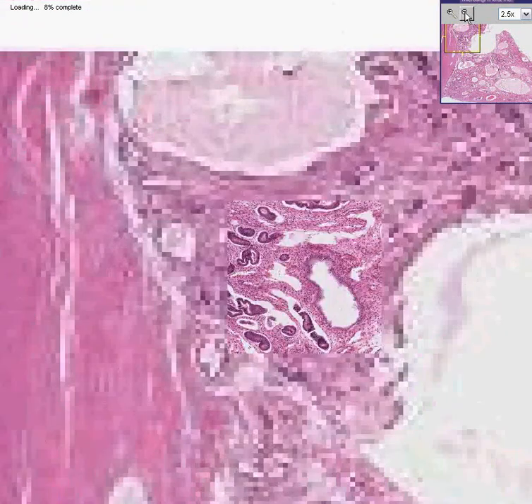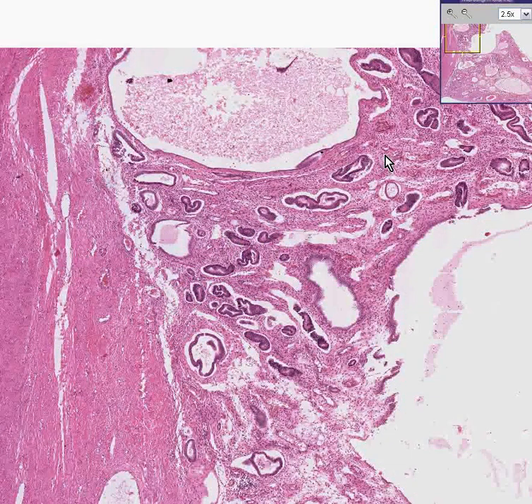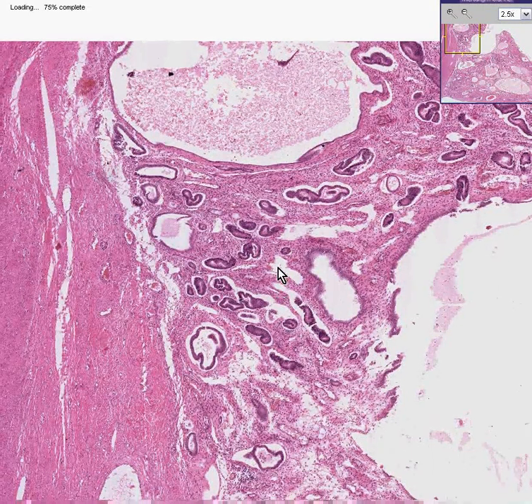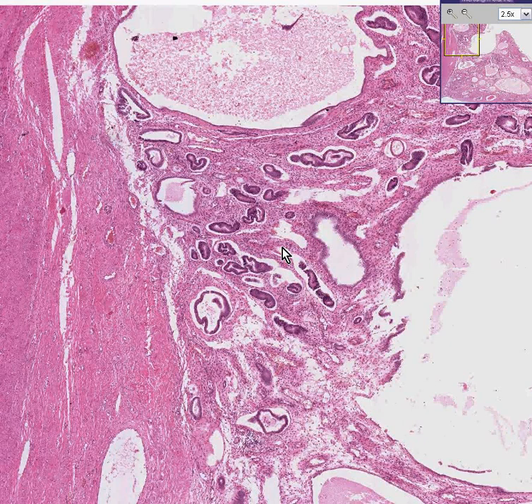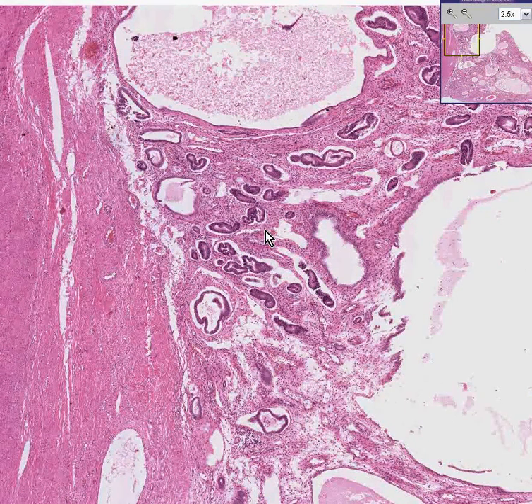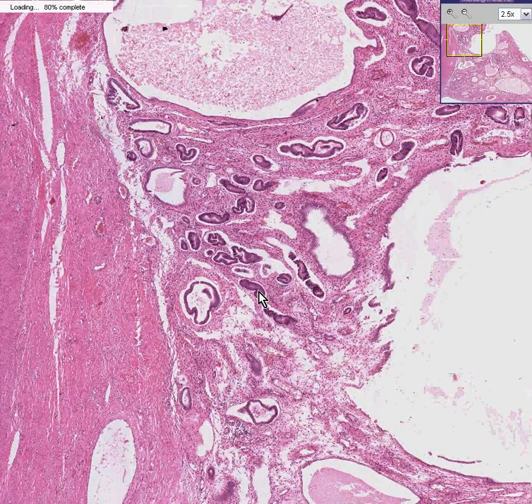If, however, you found a focus of adenocarcinoma in here, which is possible, you would no longer call it a polyp. You would call it an adenocarcinoma. This is just a boggy or lumpy or polypoid overgrowth of mucosa. Often they are not associated with increases in estrogen, but if they are very, very juicy and glandular and perhaps multiple, they could be associated with hyperestrogen secretion.